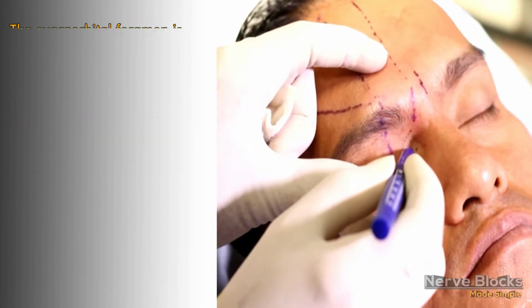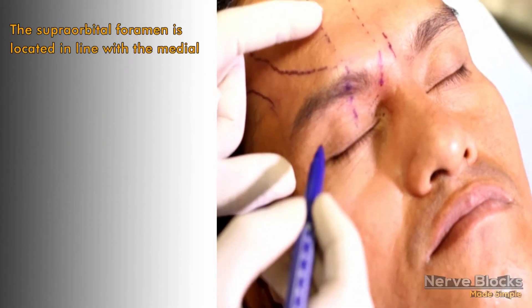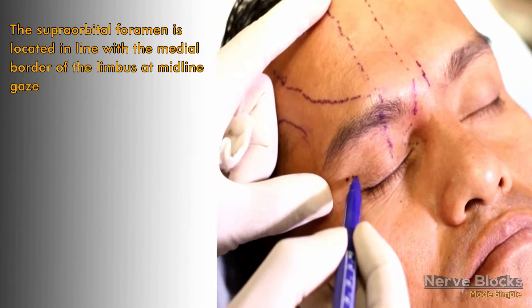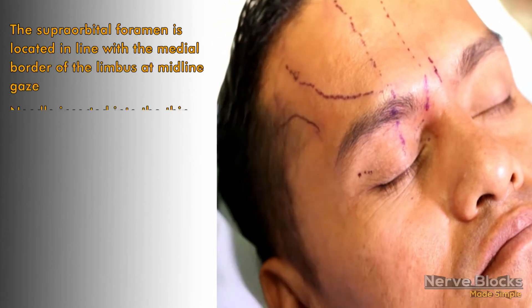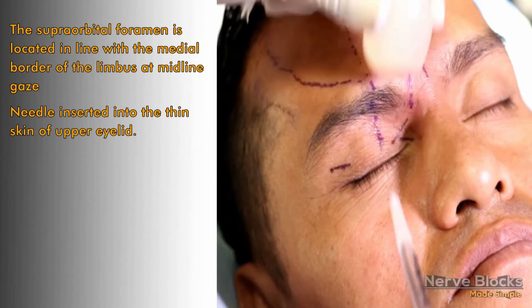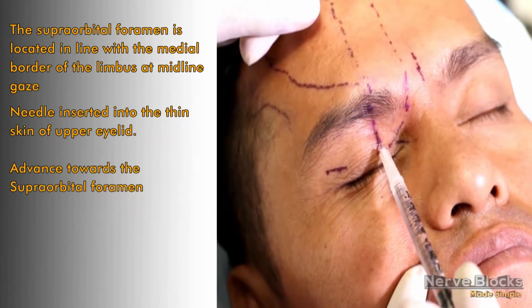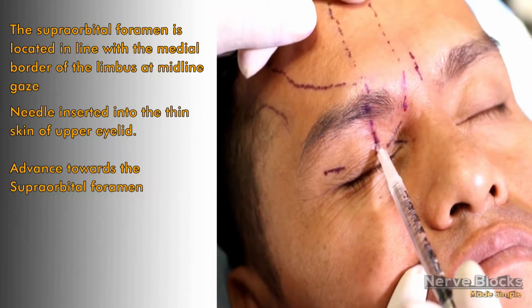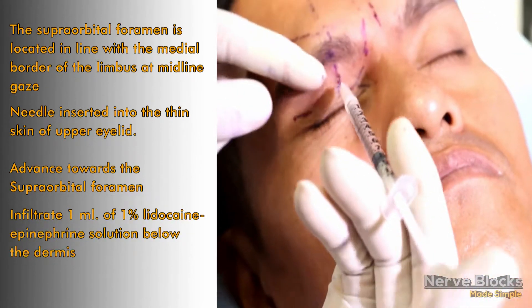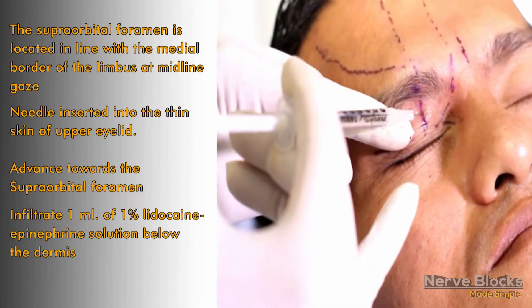The supraorbital foramen is located in line with the medial border of the limbus at midline gaze. The needle is inserted into the thin skin of the upper eyelid and advanced towards the supraorbital foramen. Infiltrate 1 ml of 1% lidocaine epinephrine solution below the dermis.